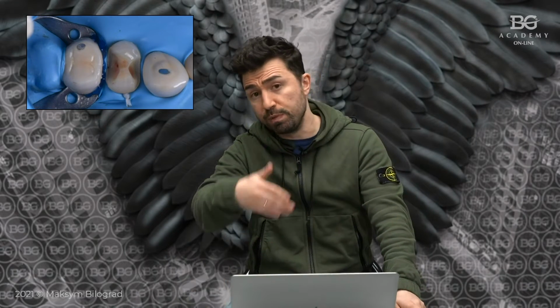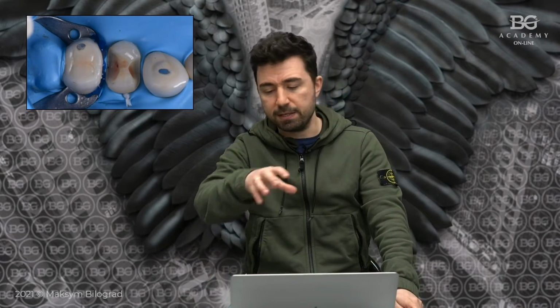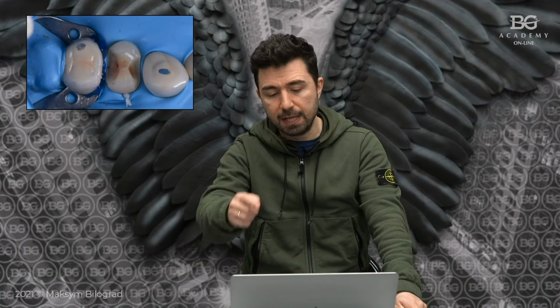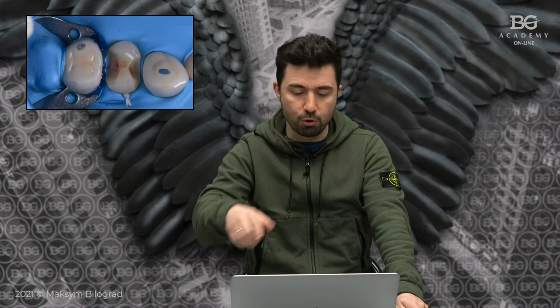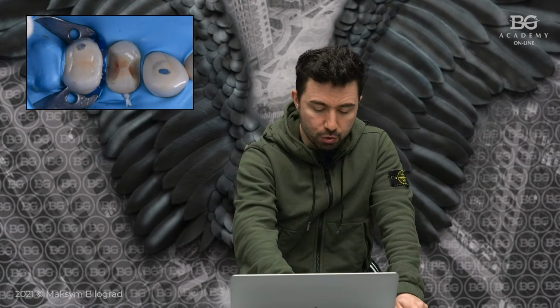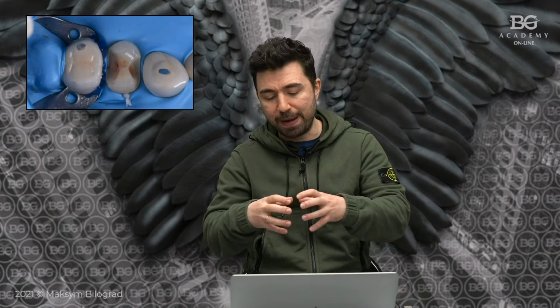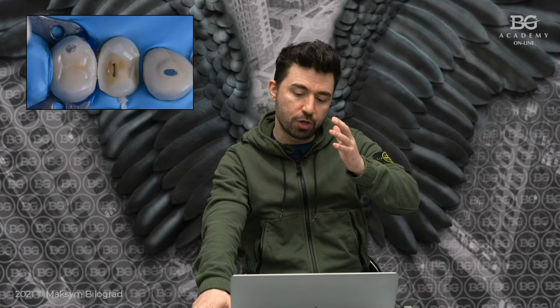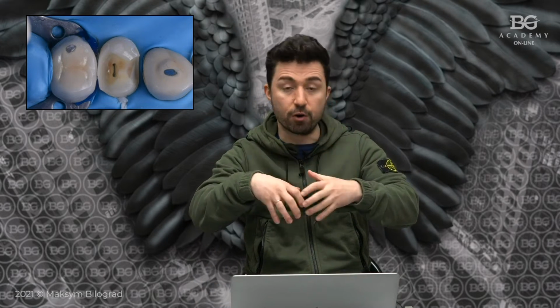As I mentioned before, we made a few perforations in the rubber dam and then we went back. We used a liquid dam to secure space because we have a bridge. So to secure this space, the zone, we use additional isolation. Then I built up the distal wall to create very good conditions for irrigation.